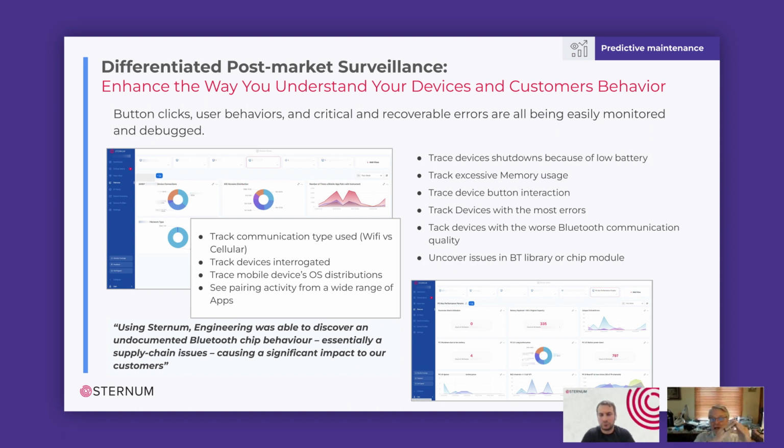And what we saw is that it would do that and it would look pretty reasonable, but all of a sudden it inverted, where there was no change in the environment, no change in the data stream, and all of a sudden we had extreme jitter alternating with really short intervals, because those long delays would queue up the data and then there would be zero delays between them. That kind of behavior shouldn't have happened. And so there's something in the algorithm on how it's servicing the low energy Bluetooth that goes off into some kind of state that recovers once the connection is dropped and recreated. So that's an area of investigation that would help us improve the quality of the performance of our product in the field. That's one of my favorite examples that matters a lot to me because these are really hard problems to get insight into.